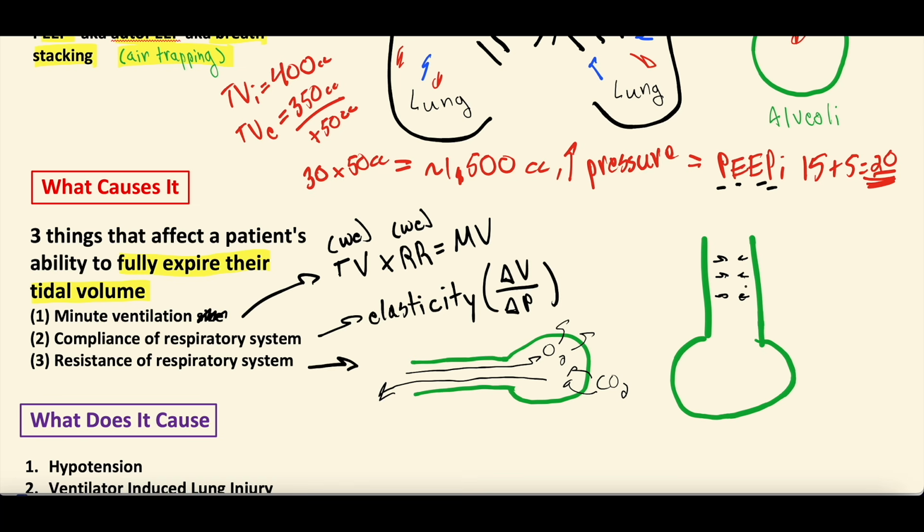when the ventilator pushes in a breath, it causes positive pressure, right? Because it's pushing air into the system, and that'll stent open these smaller airways. Well, when the ventilator's done pushing a breath in, this pressure, and again, there's some minutia to this, but from an introductory standpoint, this pressure is no longer there stenting those airways open, or it's much less.